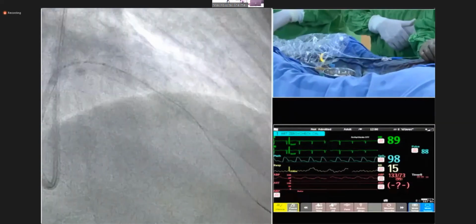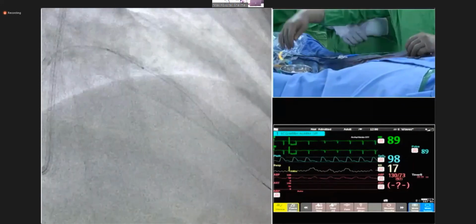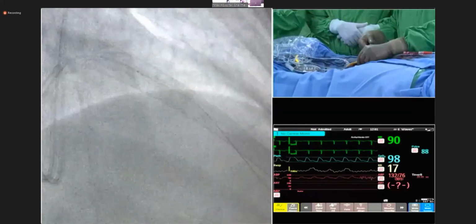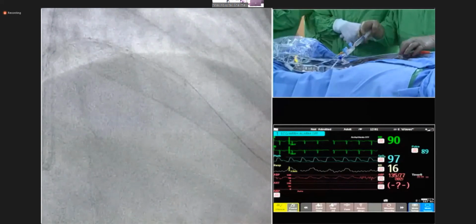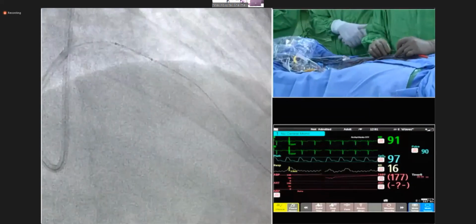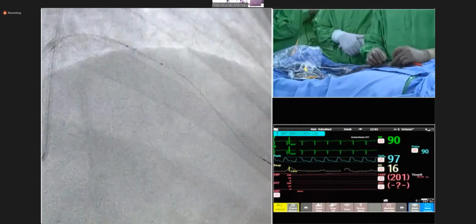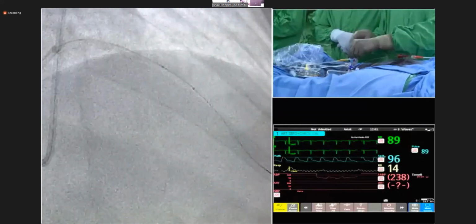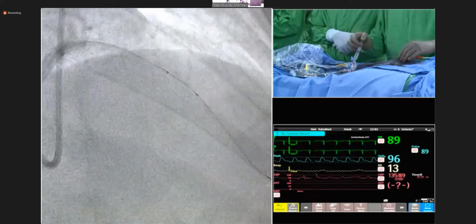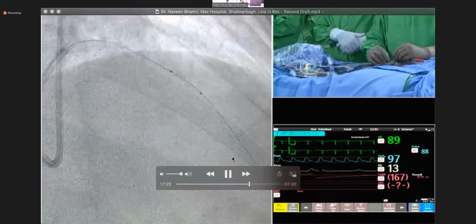And just crossing this lesion. 20 millimeter proximal to distal point. And I think it is easily crossed this lesion. Yeah, so we are inside the LAD. We should go distally, Sudhanshu. Starting from distal. Crossing okay. So we are having 80 pulses. We can use 10 pulses distally, and proximally we can use up to 40 pulses. So the strategy should be we should inflate it at 4 atmosphere. We can start from this point, I guess. We can pull it.